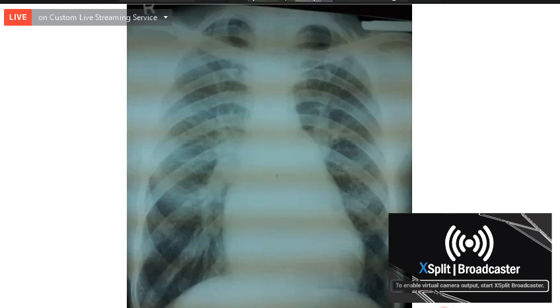Mitral valve. This is probably mitral stenosis. Obstructed TAPVC? No. What will you find in obstructed TAPVC? You can see something like a figure of 8 appearance. You can see the vessels which come up and then go to the superior vena cava, a large shadow here suggestive of a figure of 8 appearance. Here, this does not suggest that at all.